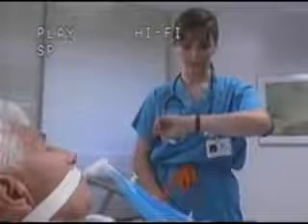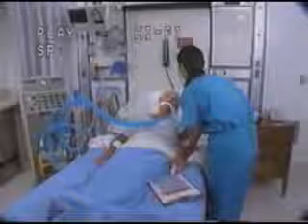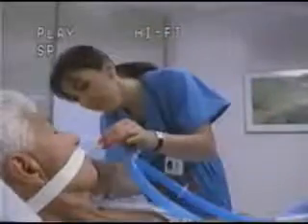The nurse also checks the blood pressure and pulse. And we'll get your blood pressure. Some patients may have become hypotensive and tachycardic when mechanical ventilation is first initiated and may require fluids. Generally, this is seen with volume-depleted patients. Your vital signs look good. I'm just going to check your ET tube right now.